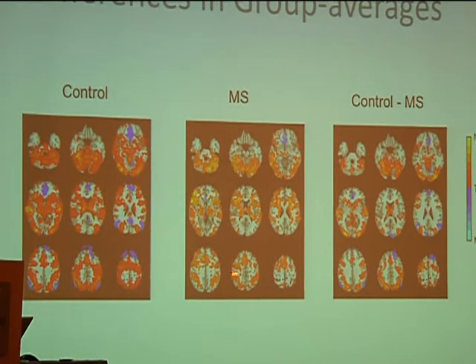So essentially the default mode network is not being suppressed in MS patients here. And when we look at the difference, indeed we see a lot of blue areas which suggest that, again, the default mode network is not being suppressed during task performance. But also lots of red voxels which show that overall task related activity is also lesser.